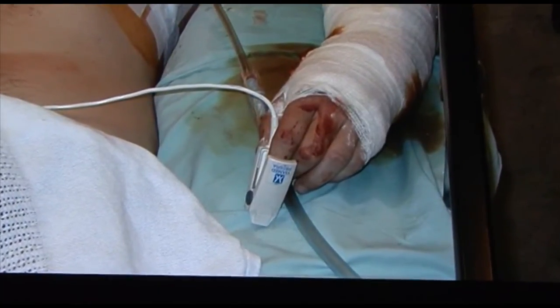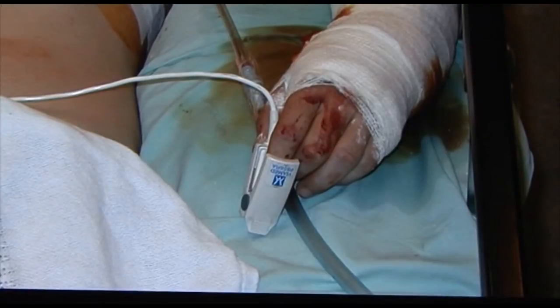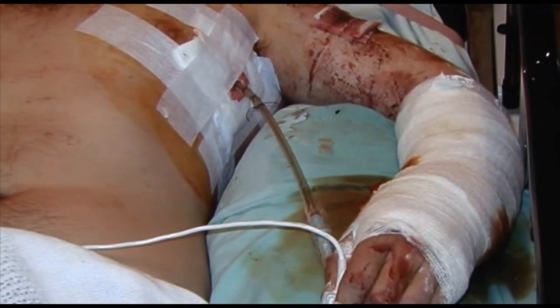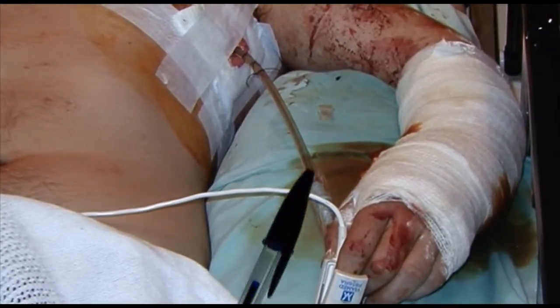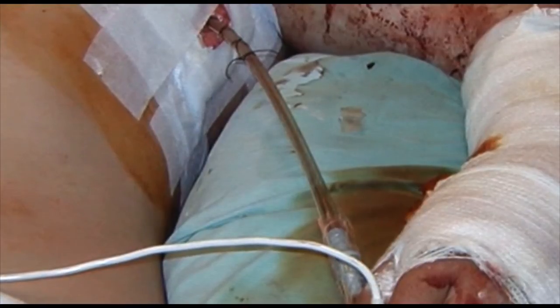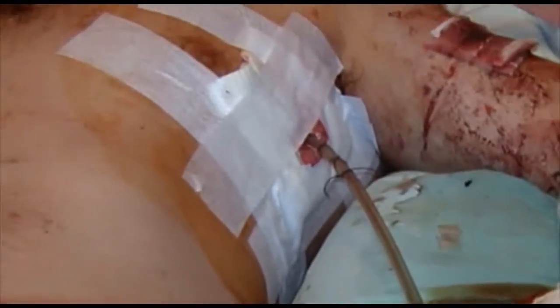If his other arm was healthy it might actually be better to have the oxygen saturation probe on a healthy arm rather than an injured one, because there could be ischaemic changes developing as a result of the arm injury — although the probe could also be useful to detect the potential development of ischaemia. Looking at the transparent chest drain tube going down, there doesn't seem to be a lot of blood in there, so we don't seem to be draining a haemothorax. This is a pneumothorax, and the air is getting out down to the underwater seal drain but not getting back in, meaning the pneumothorax is being successfully evacuated.